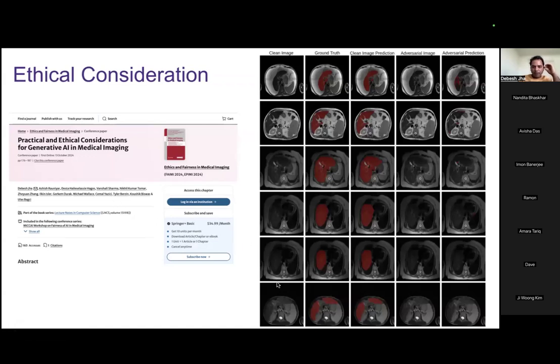And here, this is a clean image, and you have the ground truth, and this is the clean prediction from the U-Net. And we inject some noise here, and then we gave it to our radiologists. When radiologists compared the original image and the noise-injected image, they could not find the difference. But when we used the same algorithm, the prediction was really bad. This is due to adversarial attack, so we also work on this kind of domain.